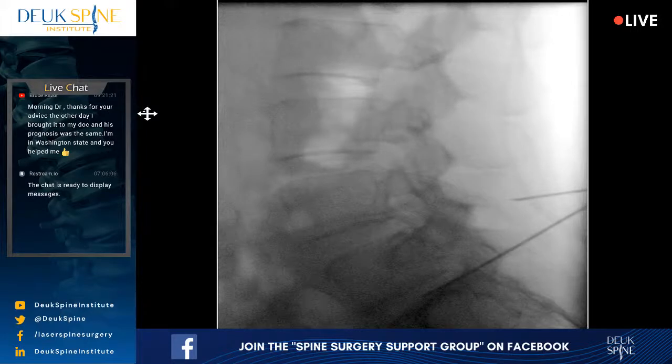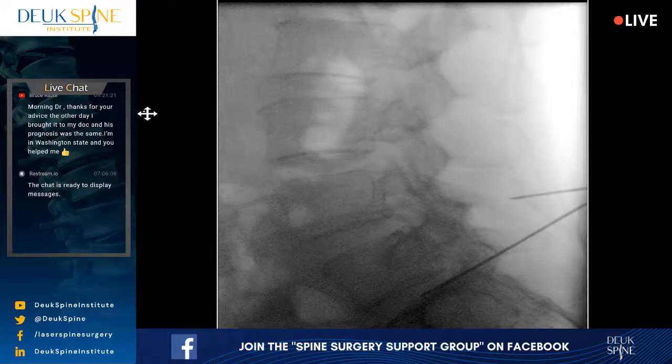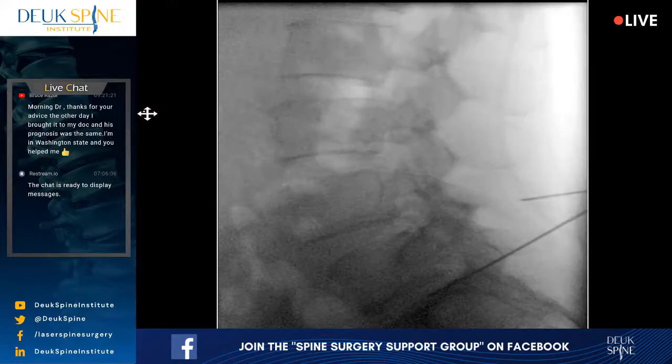All right, well, it didn't seem to improve it. Try a little more or a little less. Go one way, then the other. See if we can make it better. I think that's worse. Let's go back. A little more. All right, I think that's probably the best we're gonna get right there, okay?